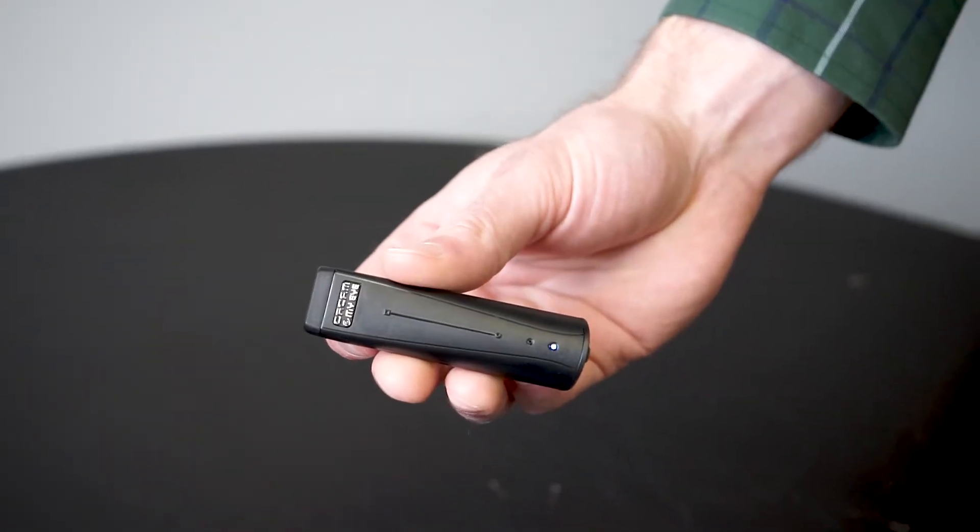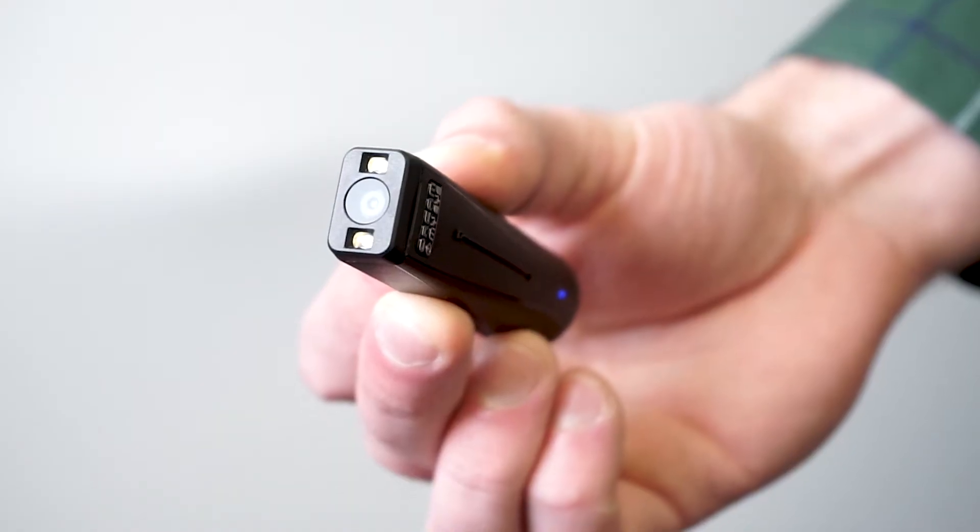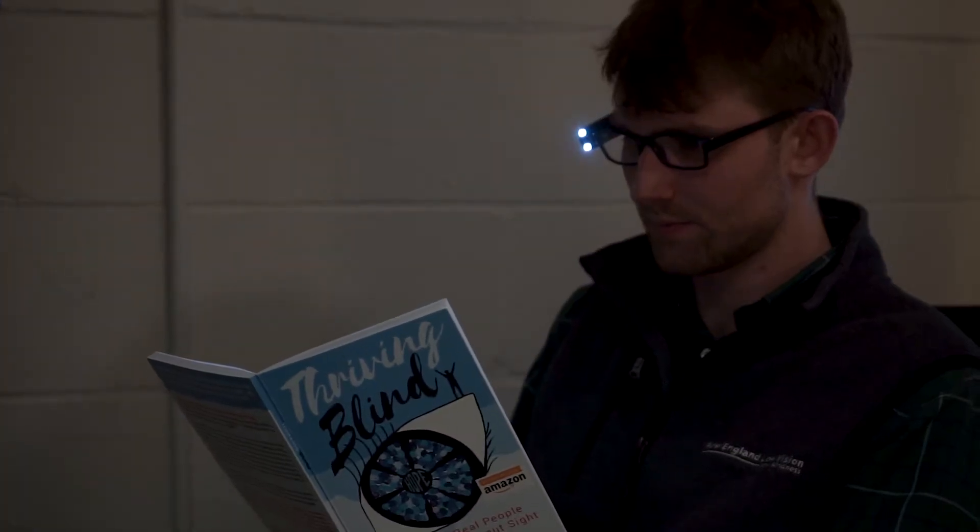The OrCam MyEye is an all-around great blindness device. Getting it in my hand, my first initial reaction is that it's very small. It has about a four-hour battery life and kind of resembles a flash drive. It does have a camera up front and two LED lights, so if you're in a low light area, it shoots out some light so it's able to pick up the text.